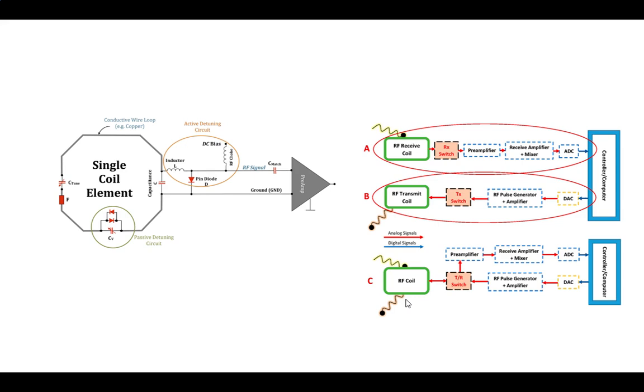There's a finite time differential for other pulses, so only if I've got a really big, powerful one is it going to create that type of change. So is the fuse just in case the detuning circuits don't work, or it's just too big even with that? The detuning is passive, so there's still going to be that initial pulse. What if that initial pulse was huge? I could still have a problem.